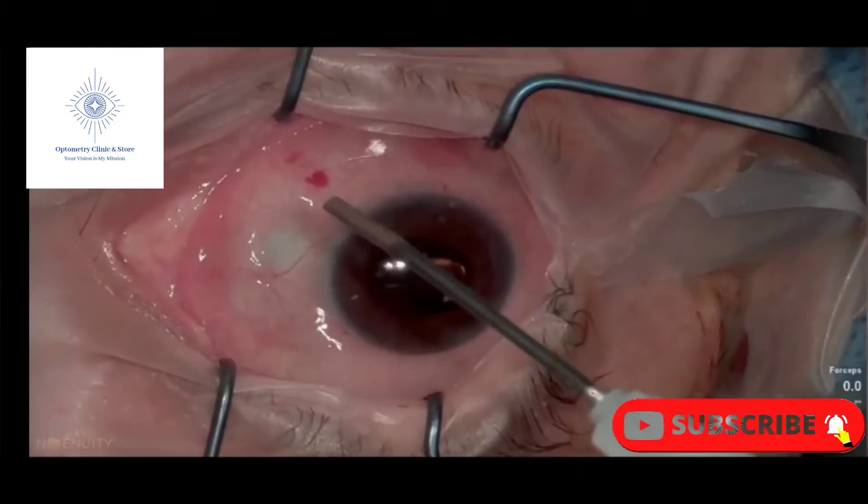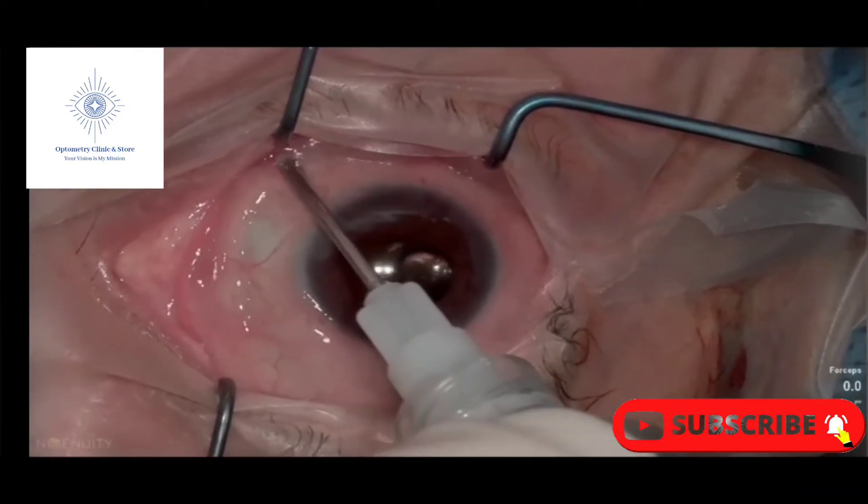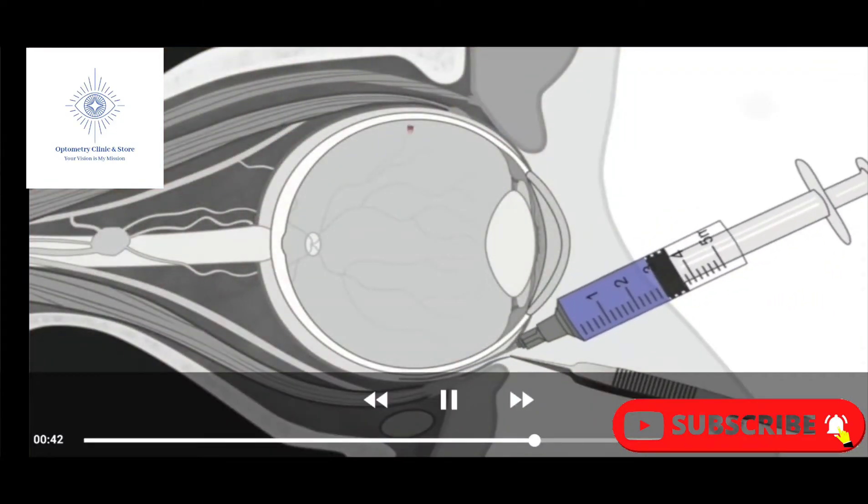A blunt-ended sub-Tenon's cannula is then inserted, extending posteriorly following the curvature of the globe, until the tip has passed the globe equator.